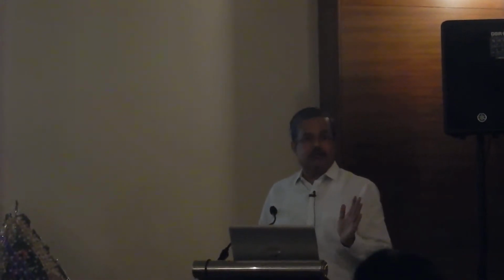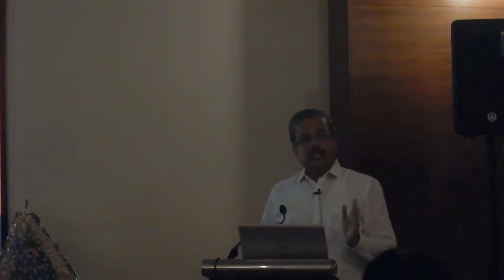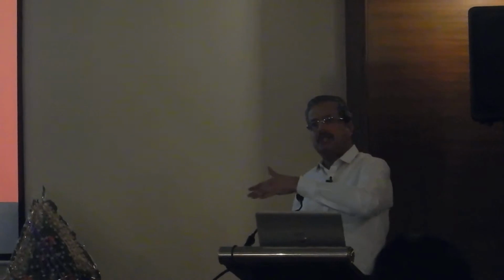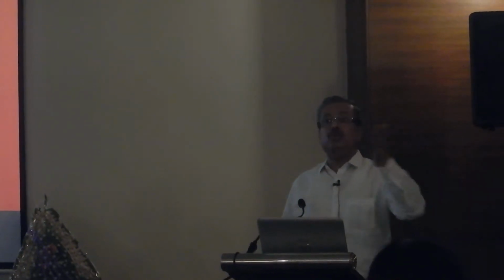Now, if you see the topographer, for example, it does not estimate the central 3 millimeters at all, because that is where your infrared source of light is. So your central 3 millimeters is always extrapolated in a topographer, and therefore your topographer is not the best instrument to calculate the magnitude of your astigmatism. It may be okay for verifying the axis, because nothing can be more accurate than that.